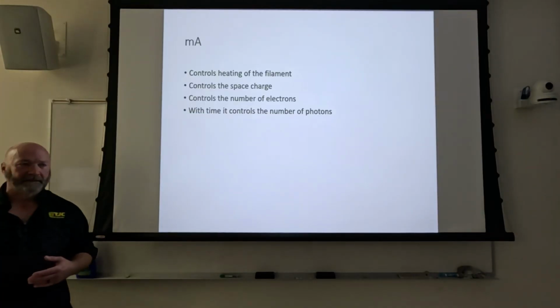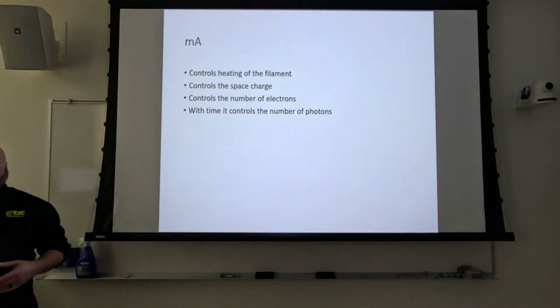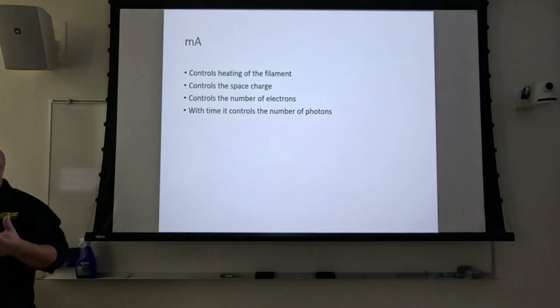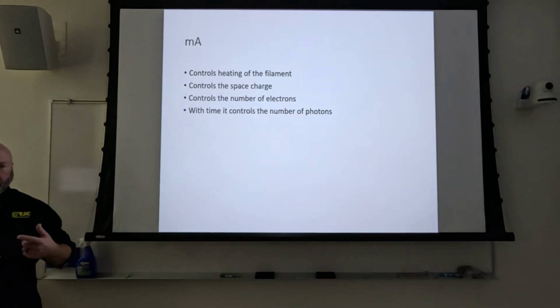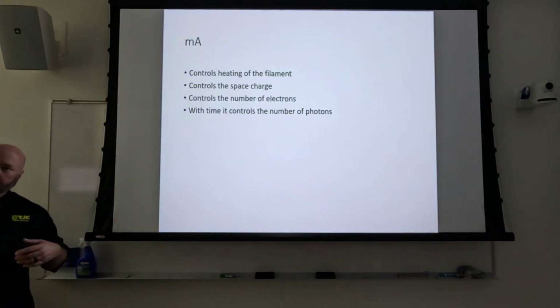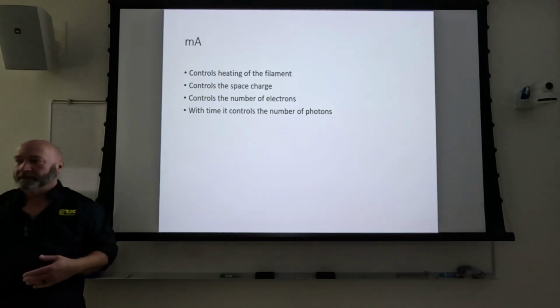Okay, so you're going to have telltale indicators that you've got things wrong in your X-ray tube. For the most part, we've focused on those things on the anode end of the X-ray tube: the burning out of the bearings, right? Cracking of the anode if we make a big exposure on a cold anode. But there are things on the cathode end of the X-ray tube too that can happen.